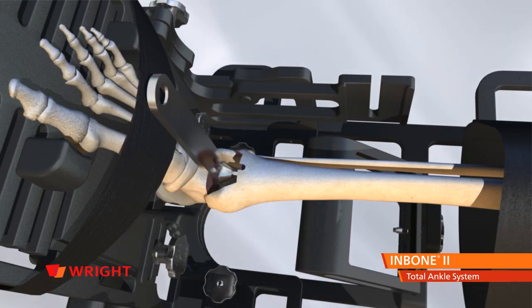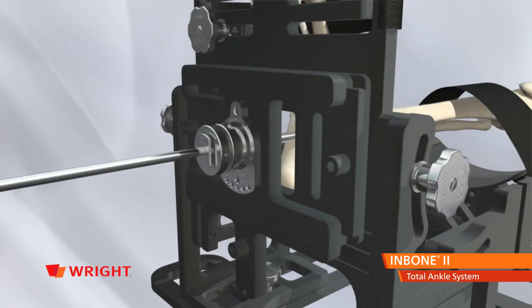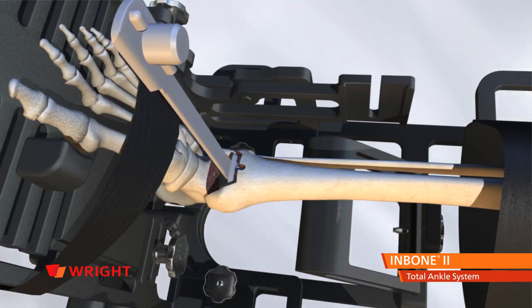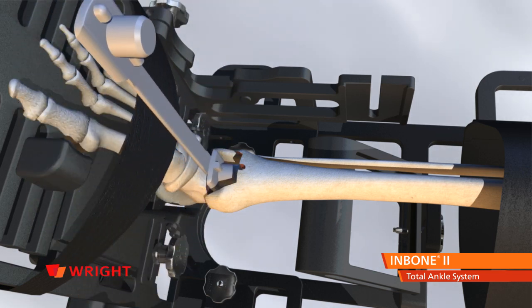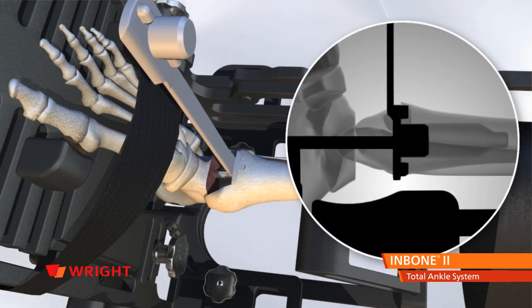Install the tibial stem wrench on the flats of the reamer tip and unscrew it from the driver. Remove the drive rod and replace it with the strike rod. Select the appropriate sized tibial tray AP sizer and insert into the resected joint space. Use both ends of the sizing tool to determine the optimum AP size for the tibial tray, standard or long.